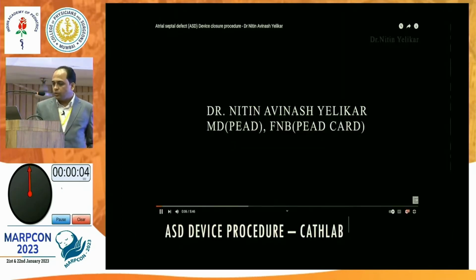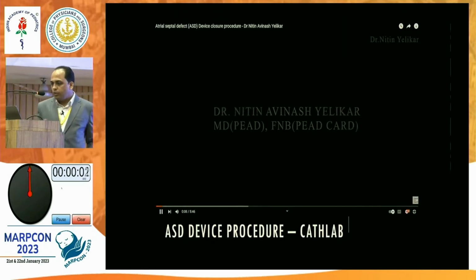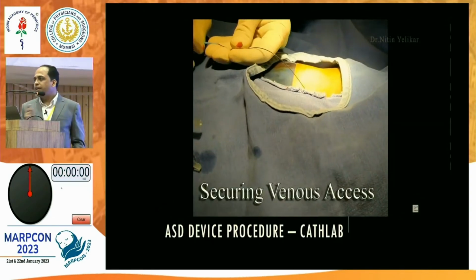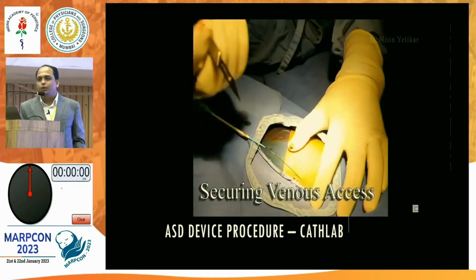So I'm just going to take you through a cath lab scenario, how we see in the cath lab. This is 2 times faster video play. Don't think Rajnikant is doing the procedure. It is me who was doing the procedure.